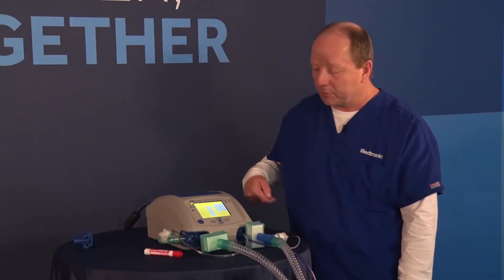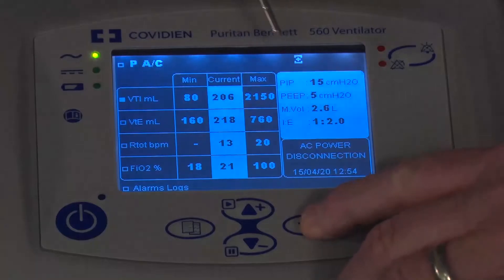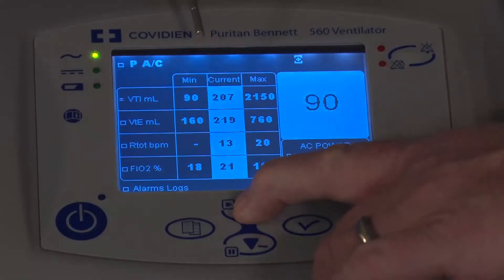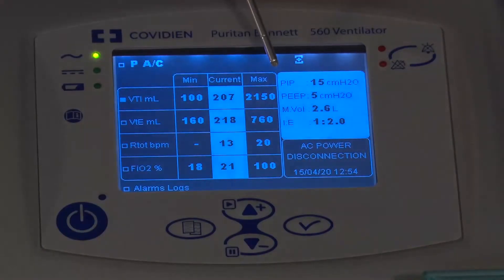Now let's talk more about alarms. On the alarm screen, I can change any alarm by navigating to it and pressing the Enter key. It highlights the minimum parameter and I adjust it with the arrows up and down, then press the check mark to accept. It then moves to the high one and I press accept there as well. The actual patient value is shown in the middle, which helps guide where to set your low and high alarm limits.